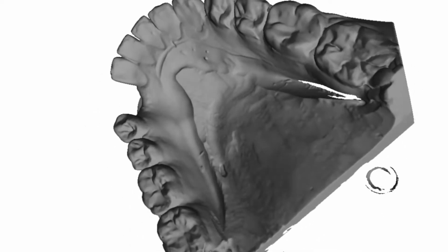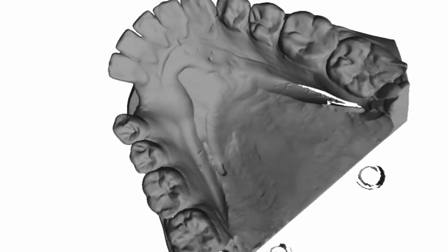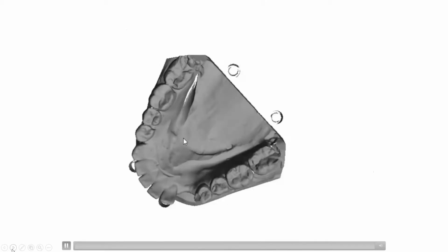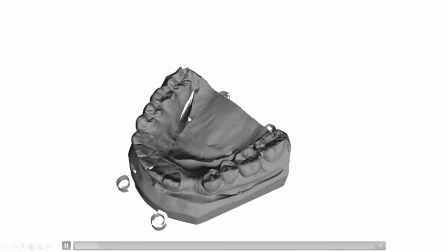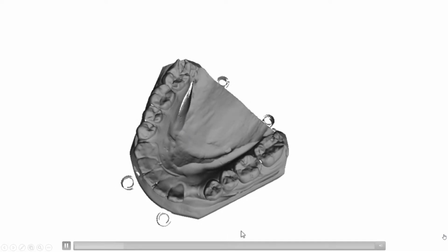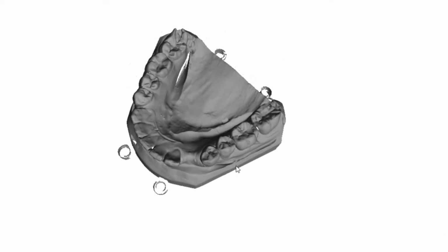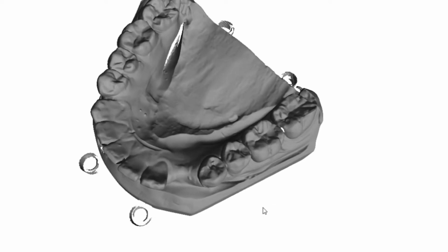And we can appreciate the dip on the labial surface here and the slight loss of ridge height. So this is what we use. We import this image, this file, into our planning software, and we can use this later on to actually manufacture our template. Now the template will be printed, it won't be actually made on this digital format or on an actual model. It will be printed digitally, and it will never actually see the model at all.